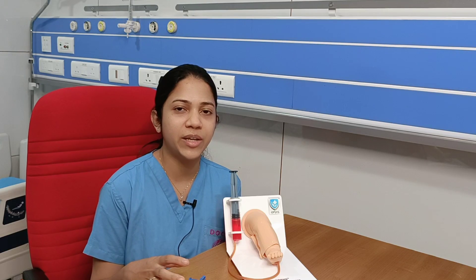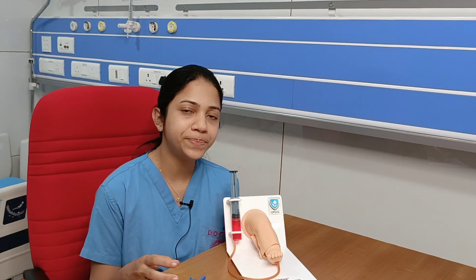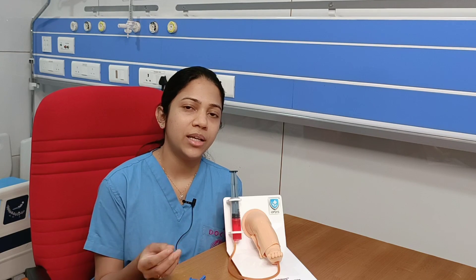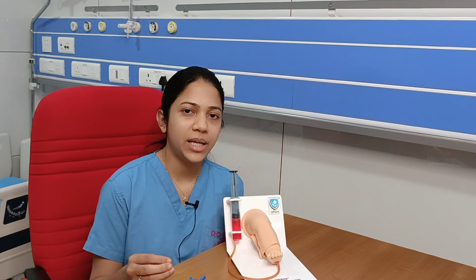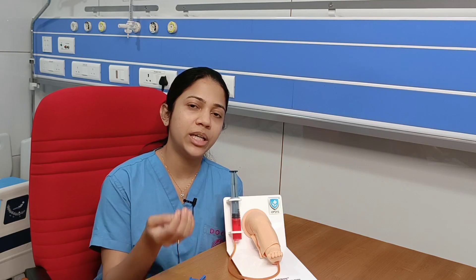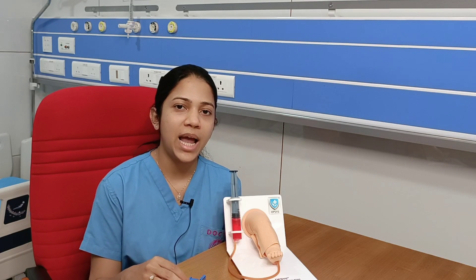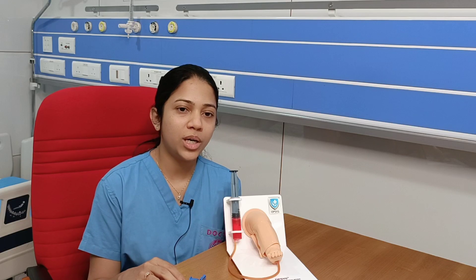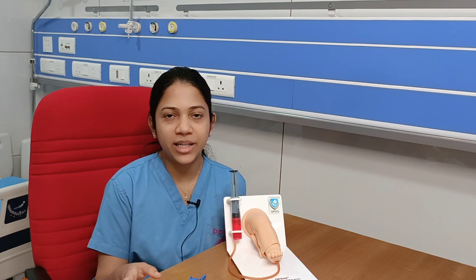By getting an intraosseous access, we insert a needle into the bone, which goes into the medullary sinus. This drains into the emissary veins and ultimately ends up in the central vein of the long bone, which then drains into the corresponding venous system.